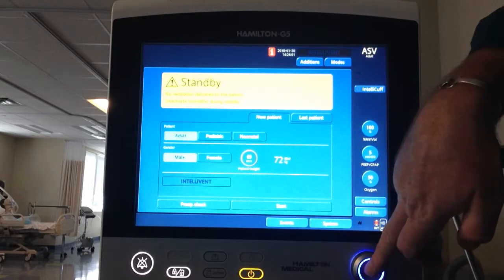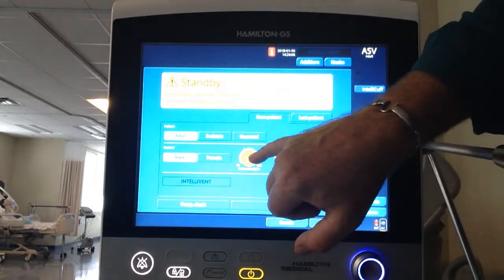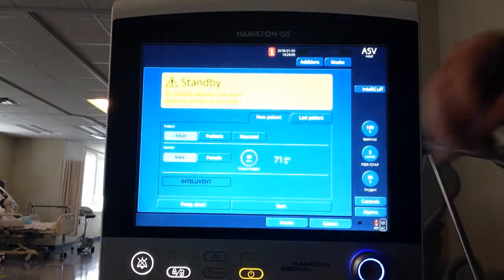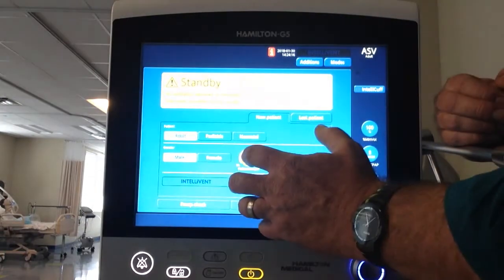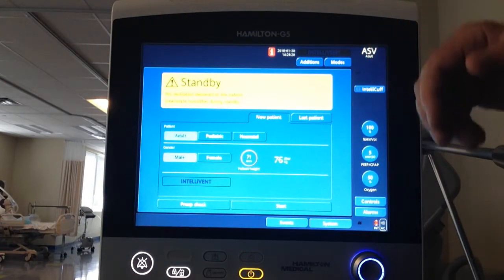So that's how you change the patient selection - you can select it, deselect with the touch screen - see the yellow ring. You can select with the knob by pushing it, and then you change everything with the blue knob down here.